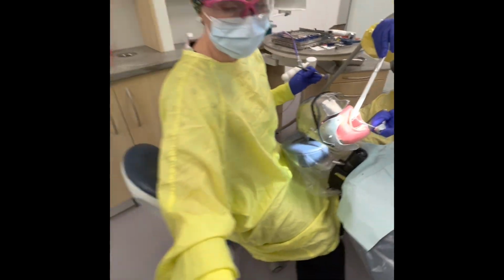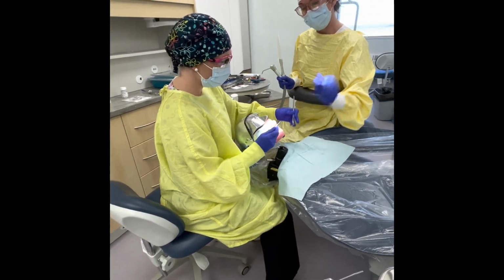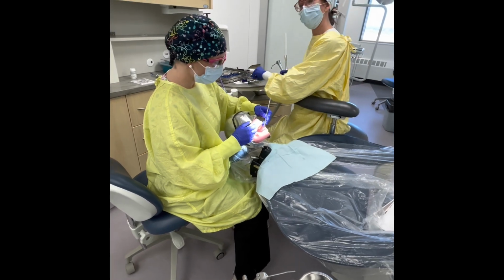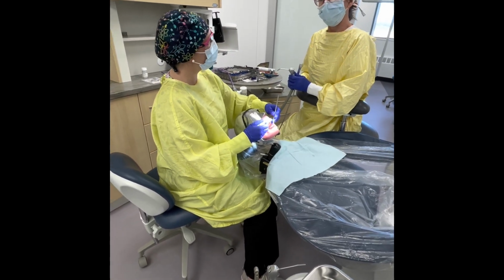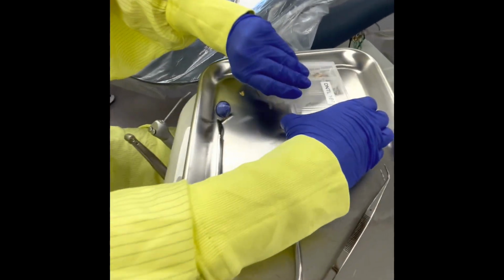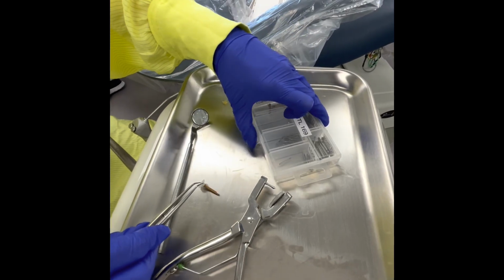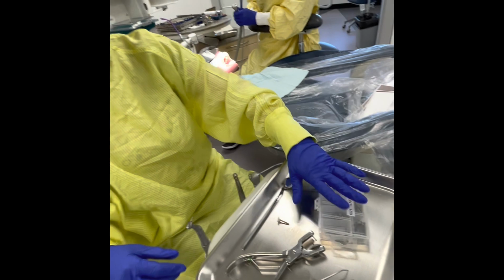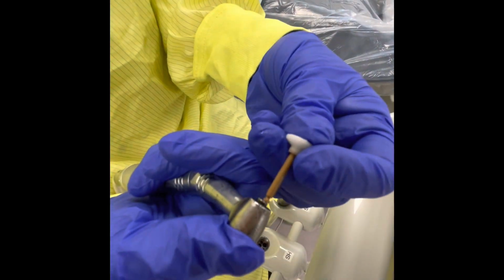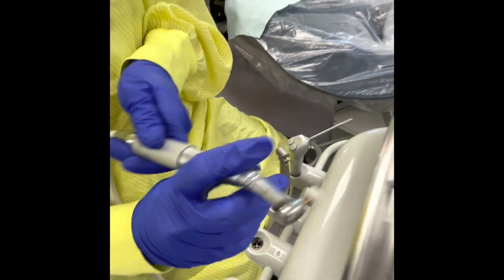Dry again. We'll check that bite again. Thank you. I'll pass that back. Well, that looks better, Stacy, but I think I'm just going to polish that with one more polisher really quickly to make sure it's nice and smooth. Okay. So your operator is going to come over to their burr block again, and they're going to get a polishing disc out, or a point, whichever they happen to choose. This is going to go into your latch handpiece, your slow speed, and they latch themselves into place.